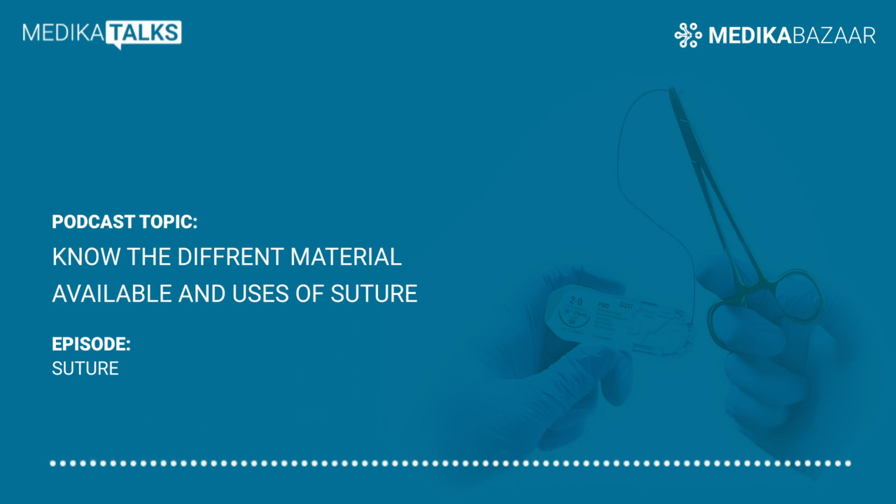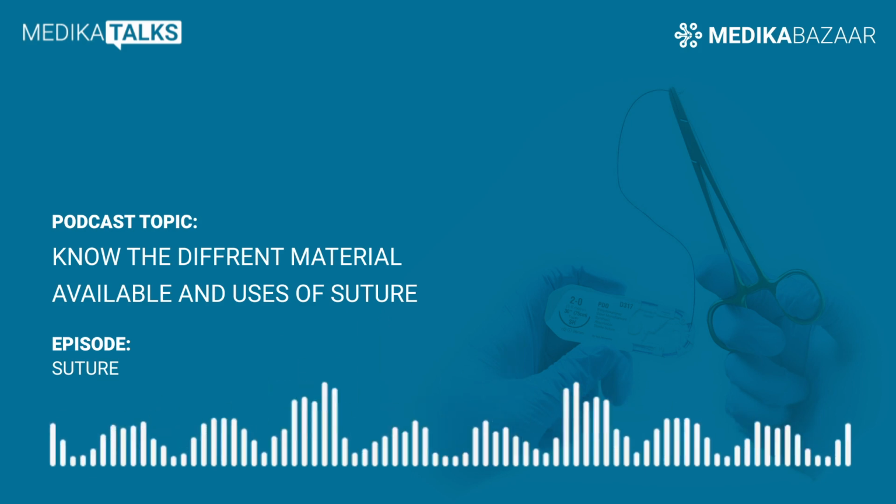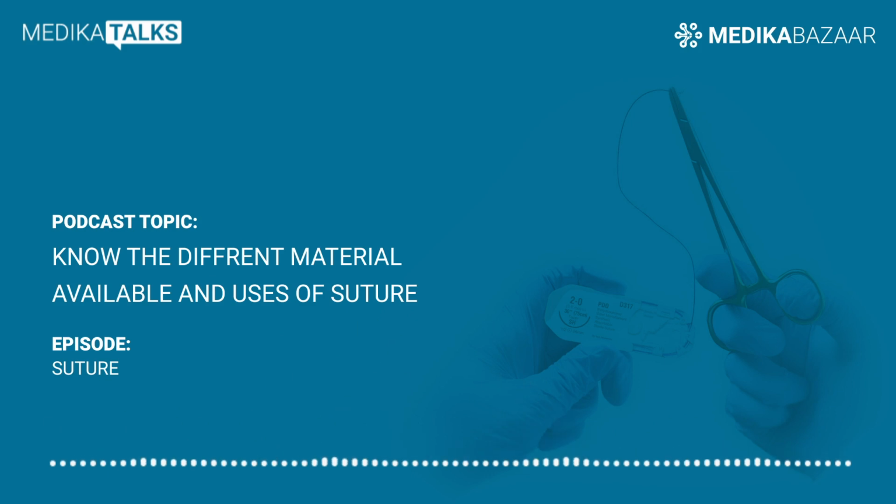Natural sutures are made of natural fibers such as silk or catgut. They are less frequently used as they tend to provoke a greater tissue reaction. However, suturing silk is still utilized regularly in the securing of surgical drains. Synthetic sutures comprise man-made materials such as PDS or nylon. They tend to be more predictable than the natural sutures, particularly in their loss of tensile strength and absorption.